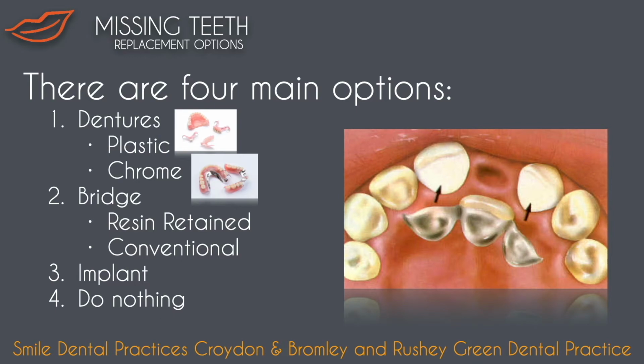The advantage with this sort of restoration is that they are minimally invasive, as we are not cutting down teeth. They are also very nice and firm, and you do not need to take them out to clean them like a denture. The disadvantage with this sort of bridge is, aesthetically, the wing behind the adjacent teeth could make the adjacent teeth look grey. Hence, at times, they are not aesthetically pleasing. Typically, this option only lasts for around 5 to 10 years.